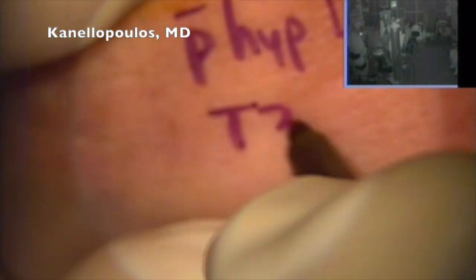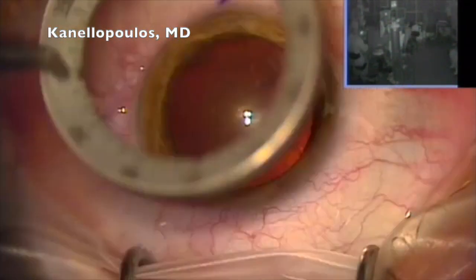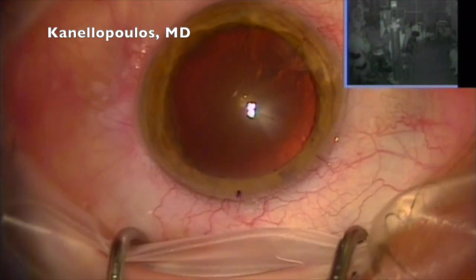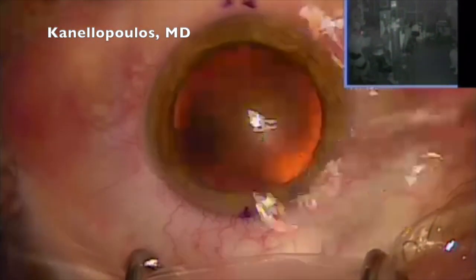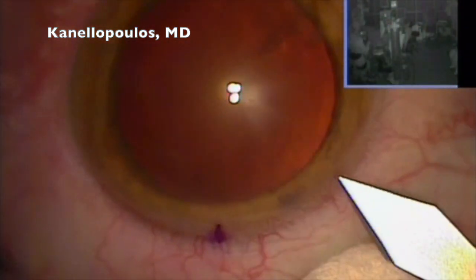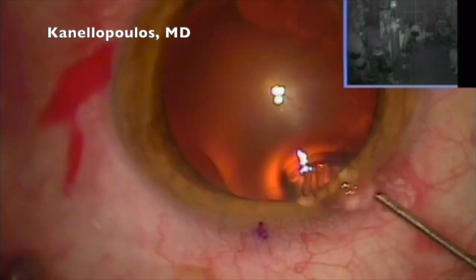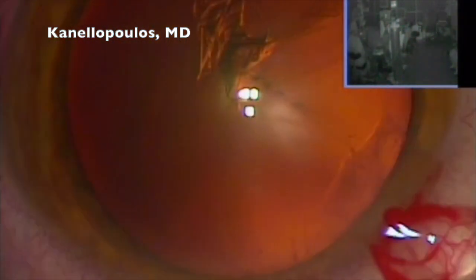Okay, good morning. We're going to do this surgical day for cataract. This is a post-hyperopic LASIK patient, in English so some of our outside Greece friends can follow this. We're marking the astigmatic direction for the toric lens, 2.75 incision, viscoed manual capsulorhexis.